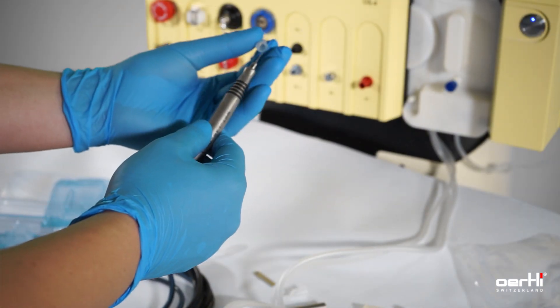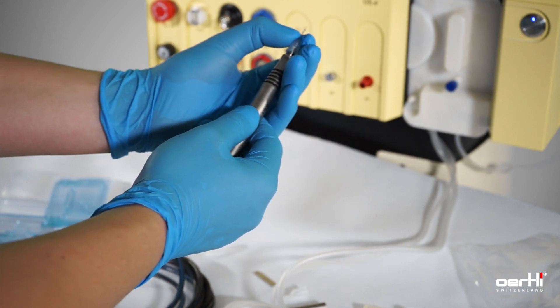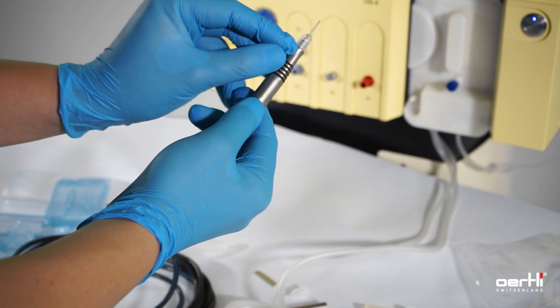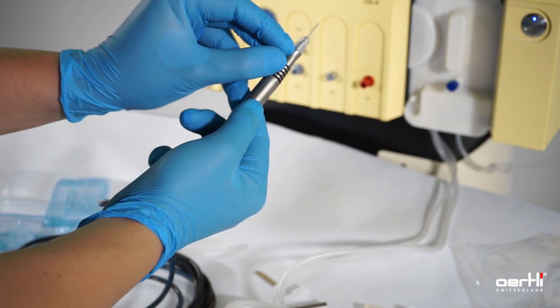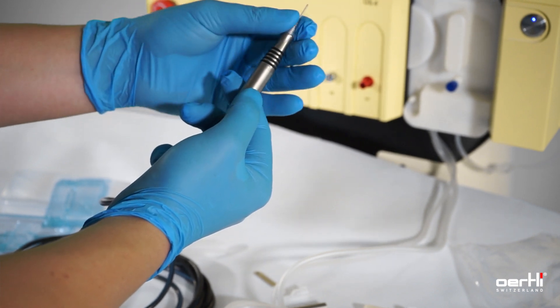Grab the sleeve and put it in place. Now, you either pull it backwards until there is a gap of one millimeter, or if you feel more comfortable, screw it down.